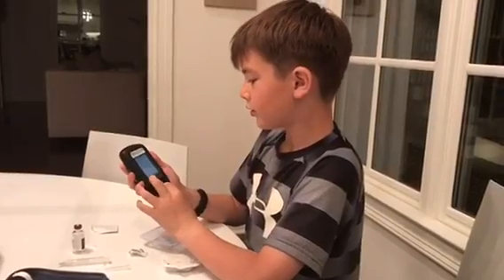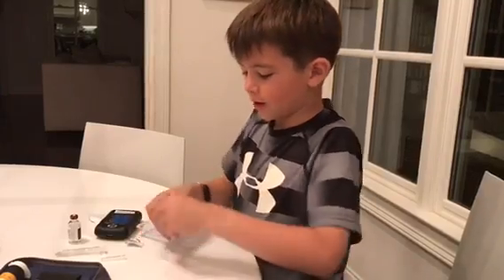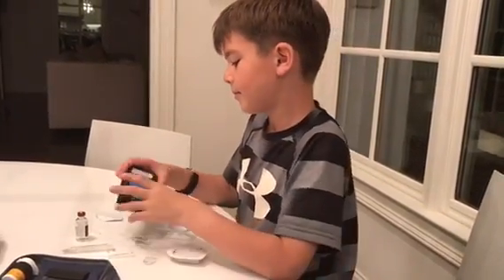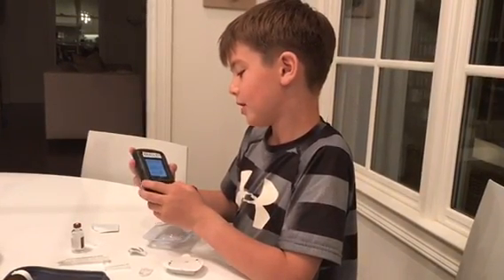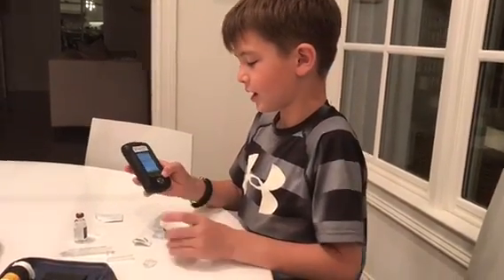Remove the pod's needle cap. Now I will remove the needle cap — you just tear it off like that. If the needle sticks out as shown below, press discard. It's not sticking out, so I am hitting next.